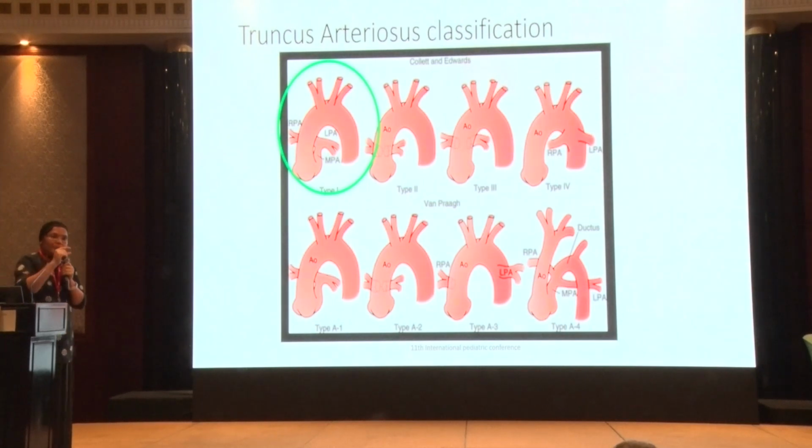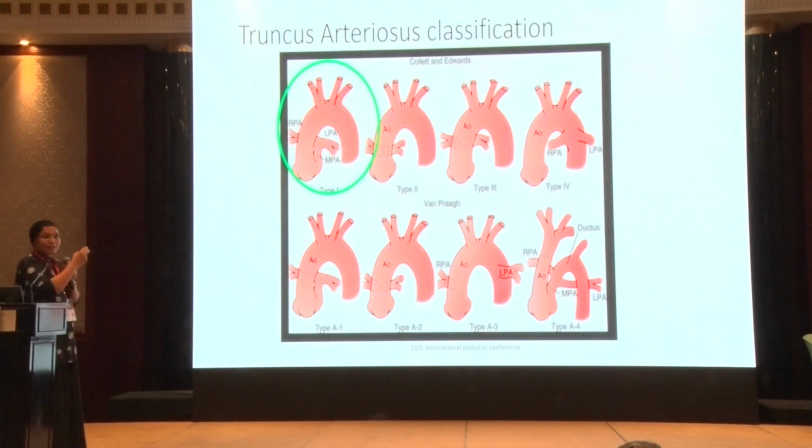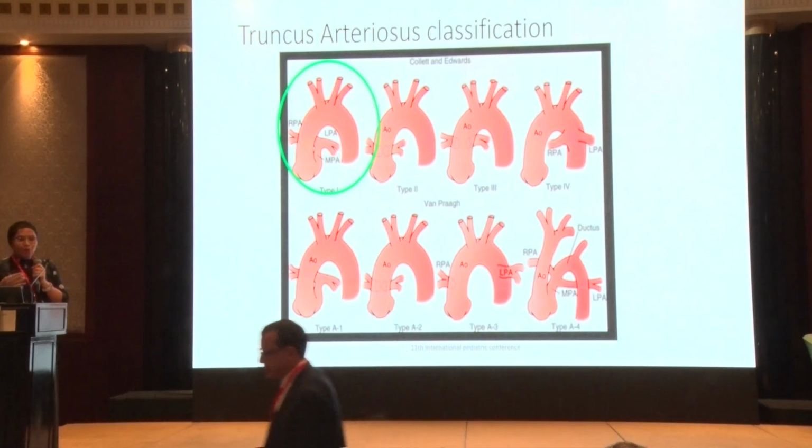The aortopulmonary infundibulum will still be there, and therefore you will see a separate pulmonary artery before the division into 2 pulmonary arteries. This classification is very important for the postnatal surgical management. This type 1, since it has a good size pulmonary artery, has a very good prognosis, and it is easy for the surgeons to operate on it.